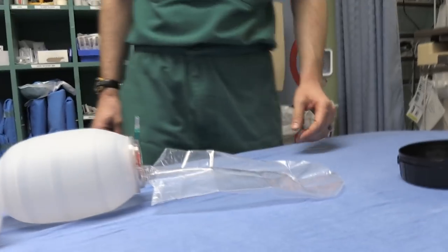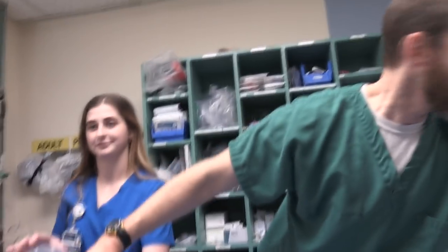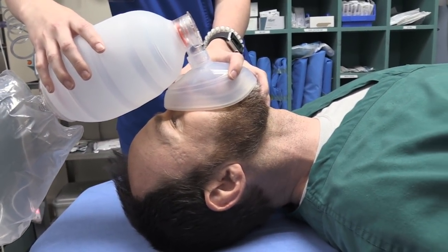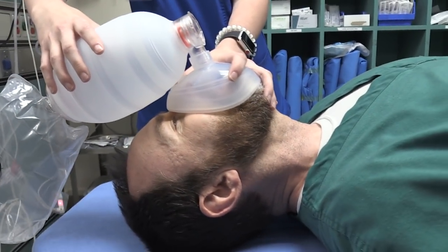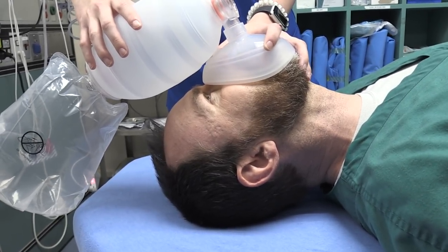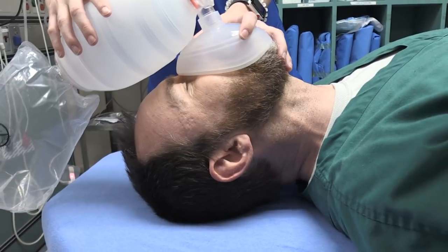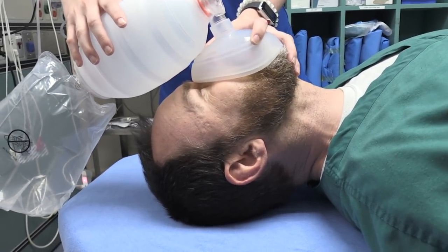Now grab the oxygen tubing from the other one. Tim's got a beard, so we're going to see how this mask works with the bearded one. That feel okay? Now, Tim, go ahead and breathe and tell us how this feels. It feels effortless. You're collapsing the bag a little bit. I would say that there's a slight resistance, but not significant by any means.